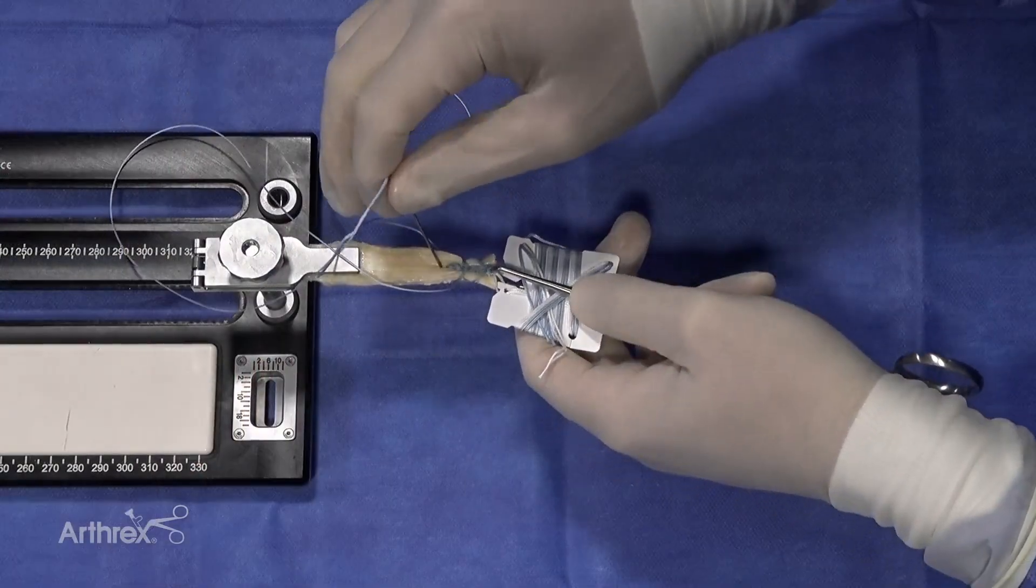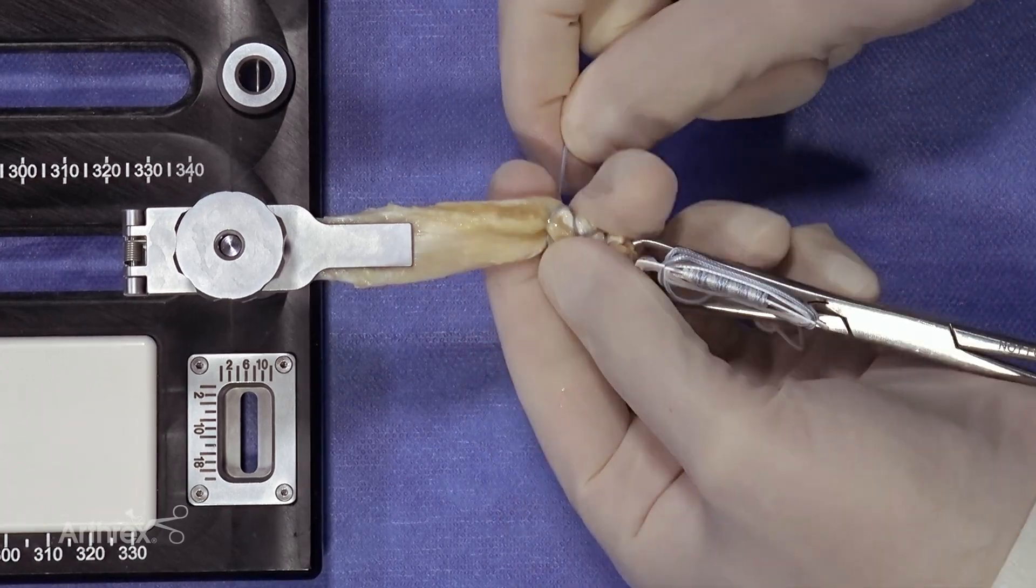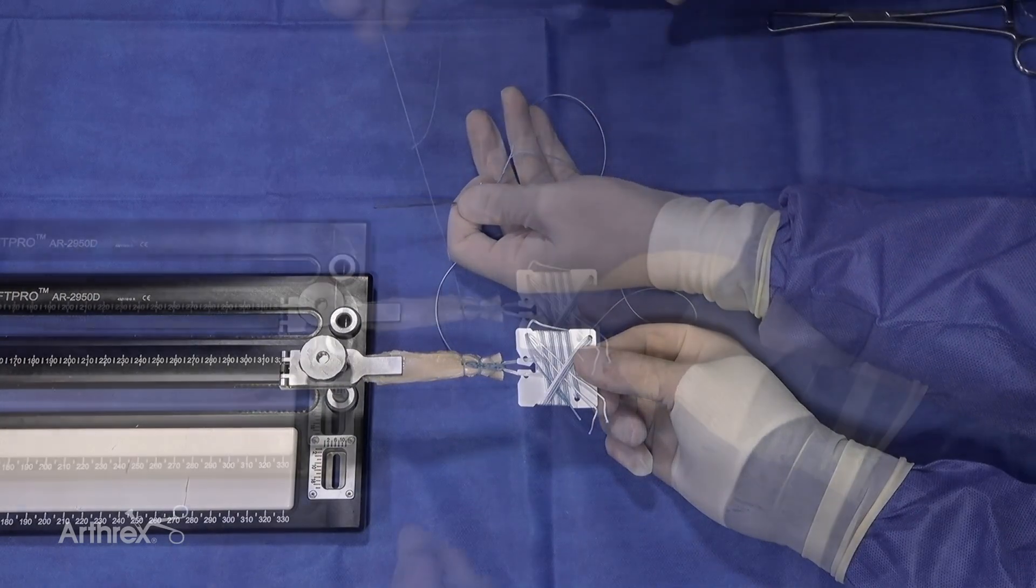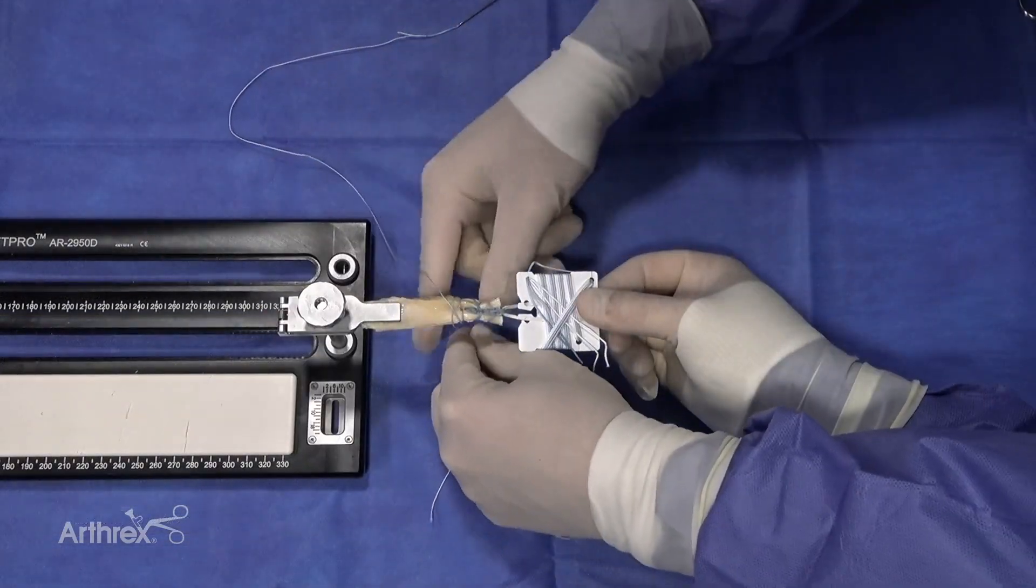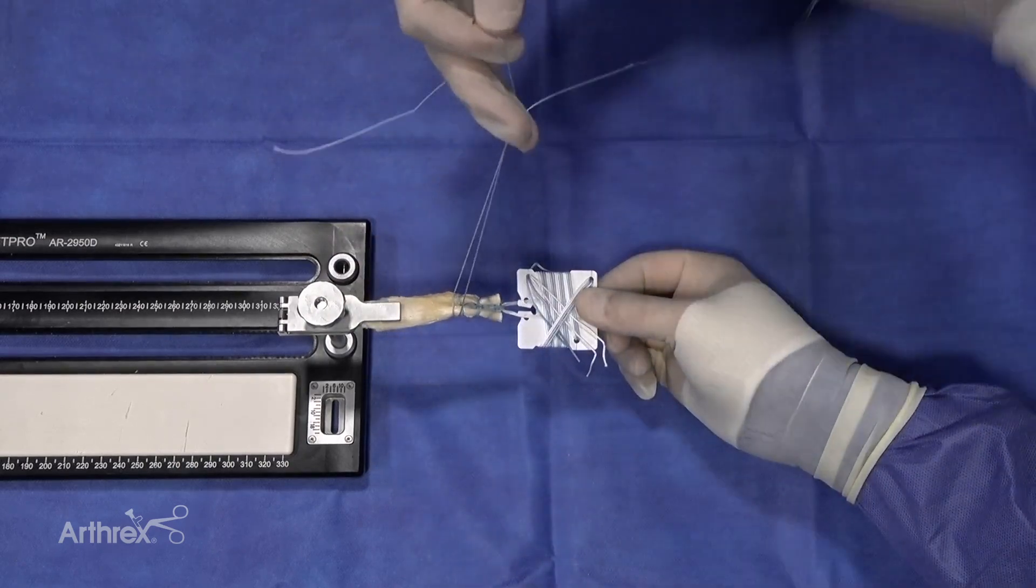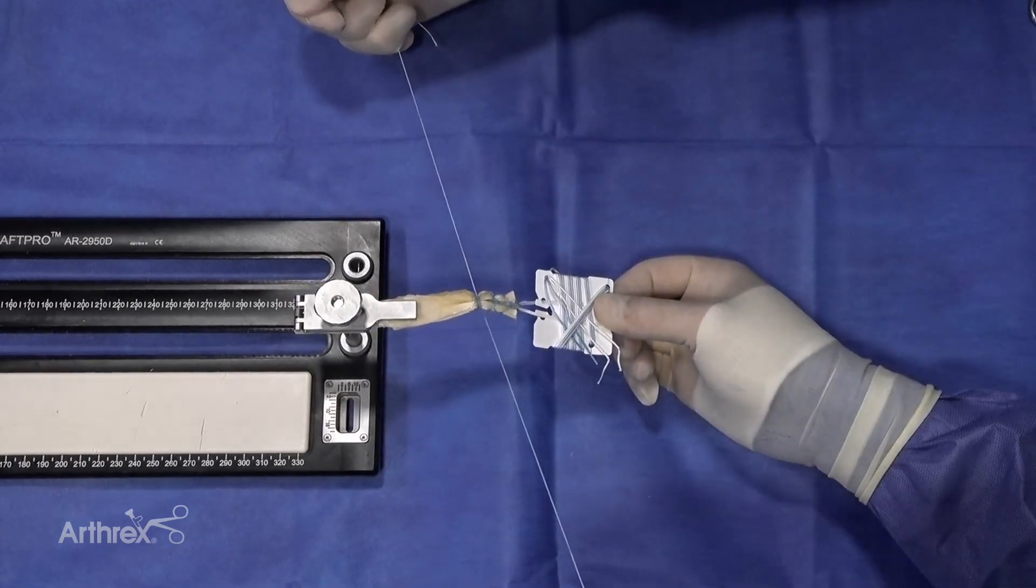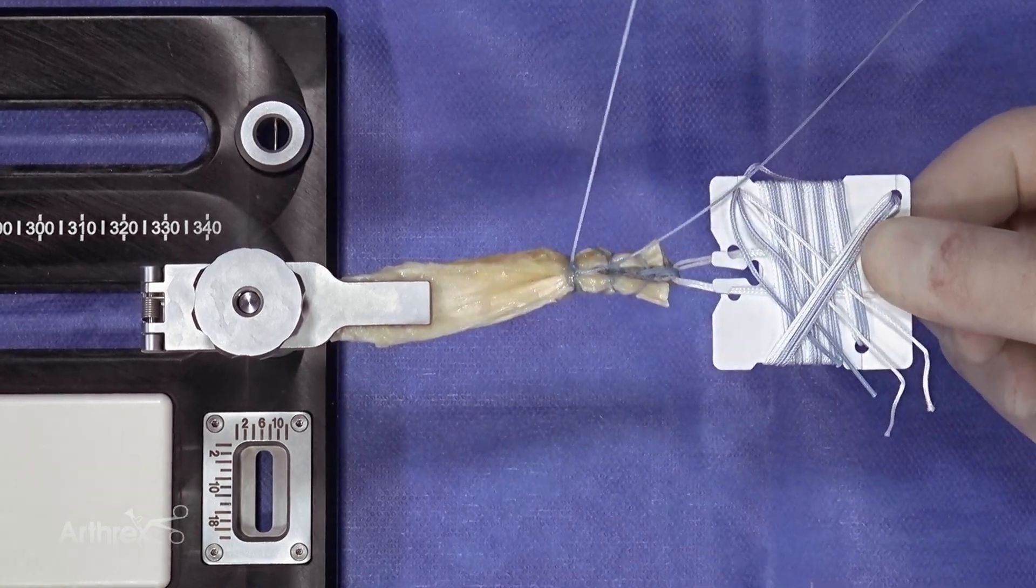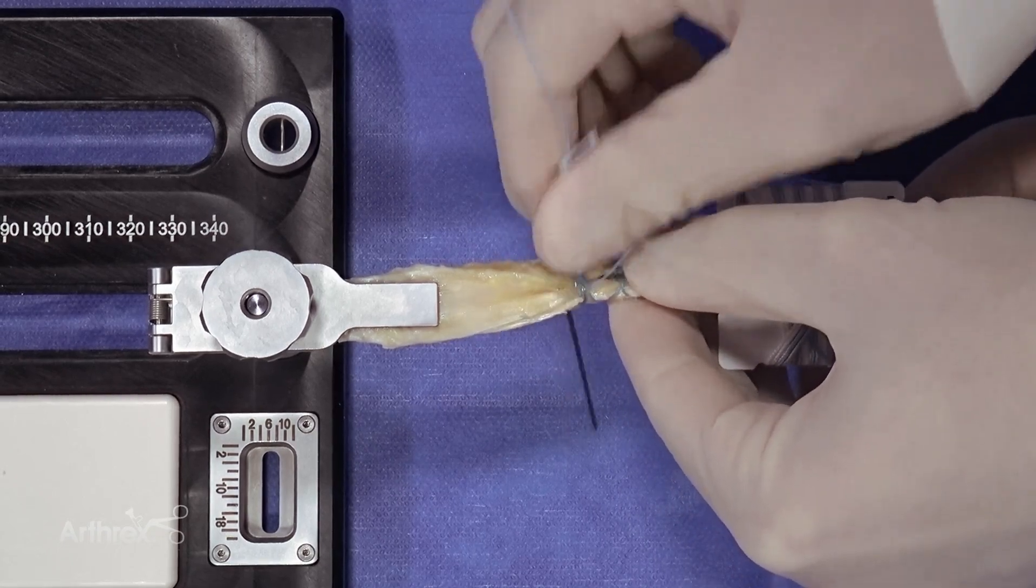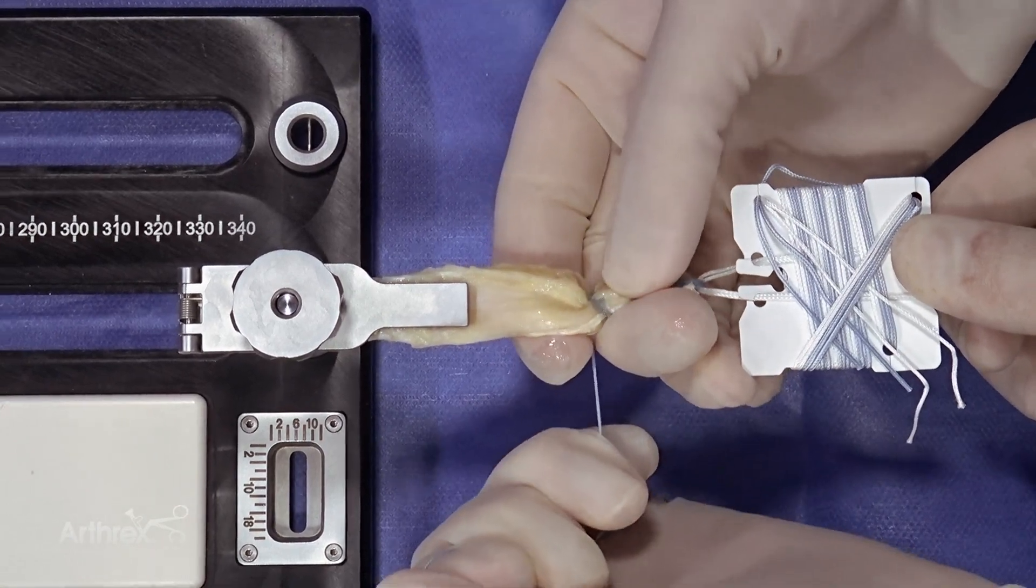When we throw the next stitch here you can see it tubularizes it. We pull hard, then cut one limb of the suture so the needle remains on one part of the suture. You'll see where that's important. We then make a simple tie, tighten it down, throw another loop to lock it, then cut the end without the needle. We take the needle and bury the knot. This is important so it does not get caught on the aperture of the tunnel when you're placing the graft.